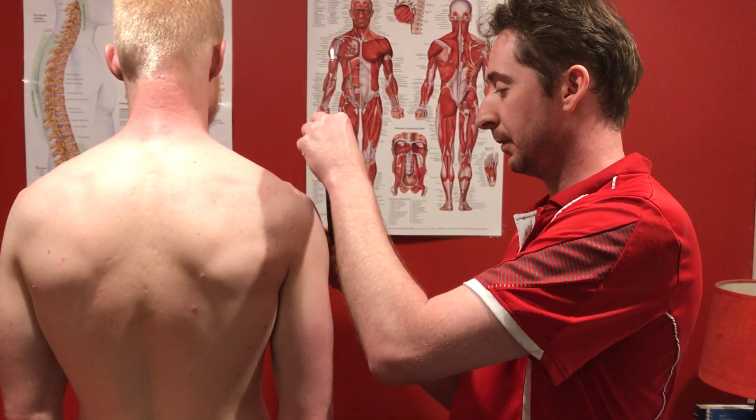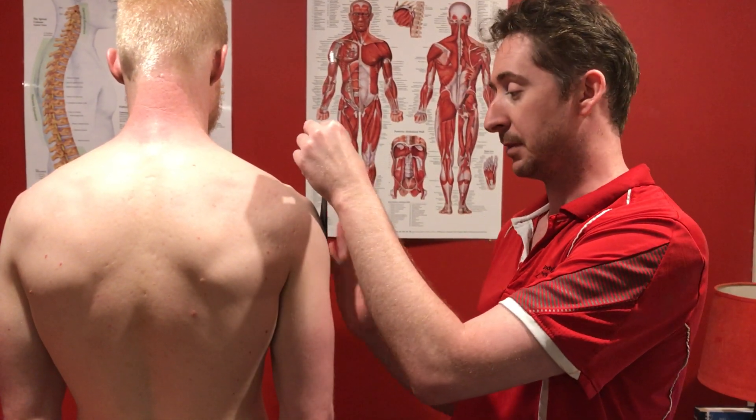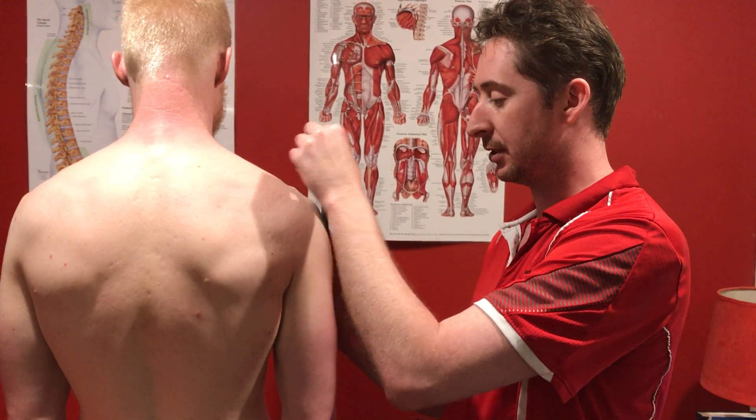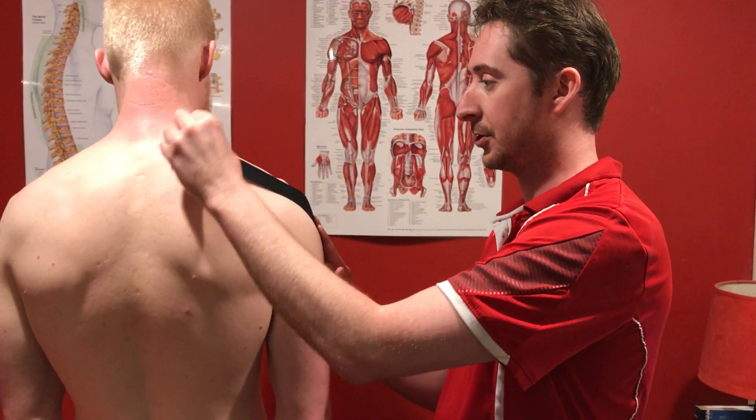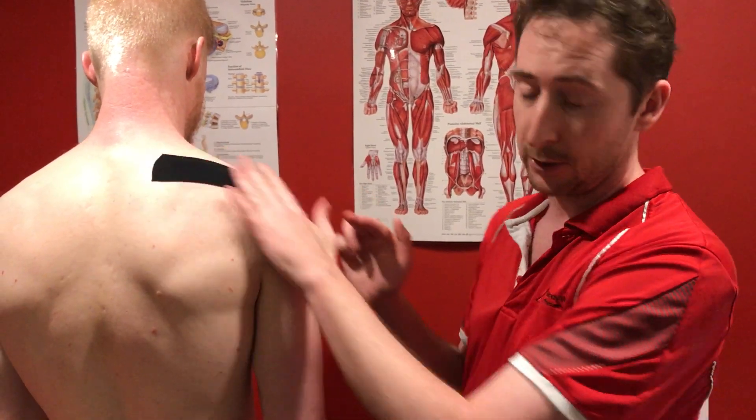Our first one — and you can do them in any order — but I'm just doing the middle one first. So middle one, attach it, stick it down for the first inch, stretch across just along that line, just lower below the upper traps.